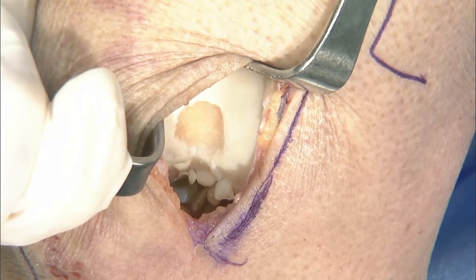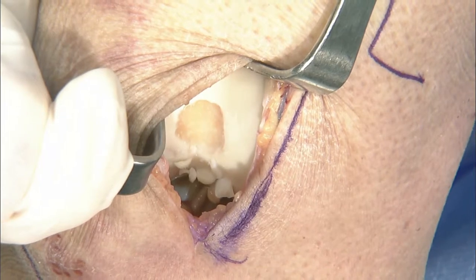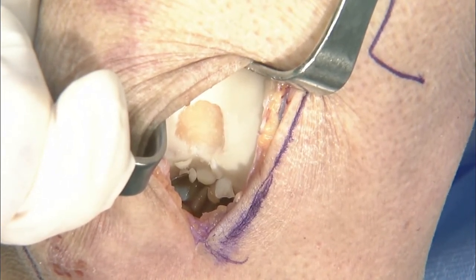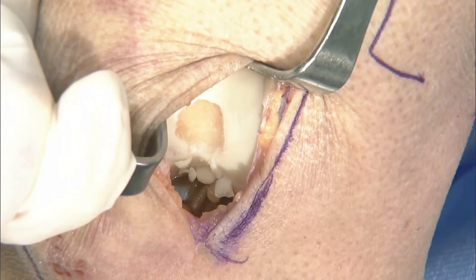But for non-contained defects, for me, that's been a bit of a change from the ACI where you need to make sure that you have that watertight seal. Now you can really just make sure that implant is stable. And it's relatively easy to test by just cycling the knee.